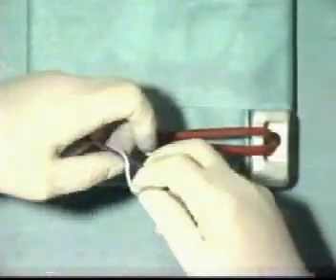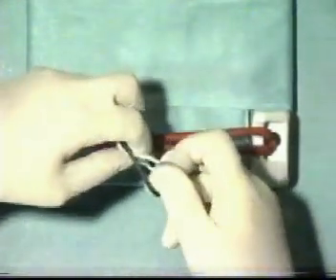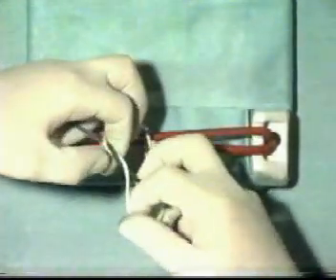However, repeat the same procedure. One throw, as for the reef knot, and then take the thread through a second time.